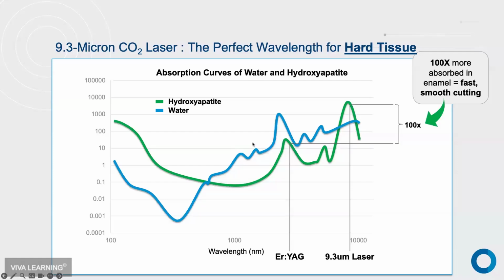But look all the way over here, there's this huge peak absorption for water, kind of where erbium lasers fall. When you shine that wavelength at water, water so very efficiently absorbs it that the water molecule itself ablates, rips apart, vaporizes, however you want to say it, and that is how it, quote, cuts.